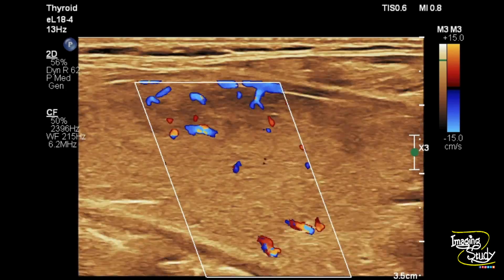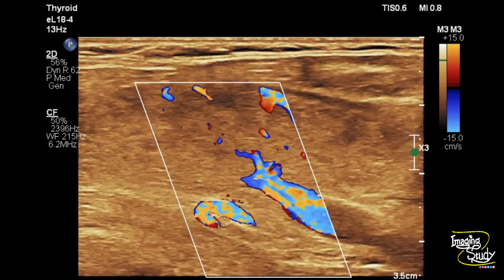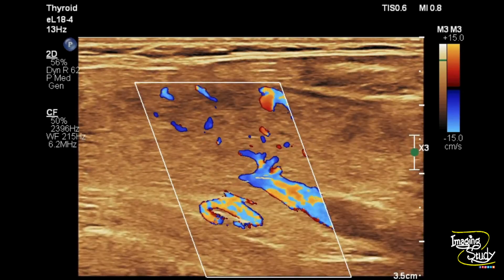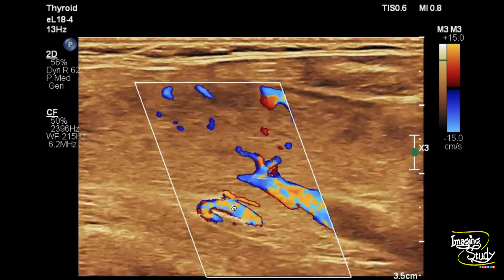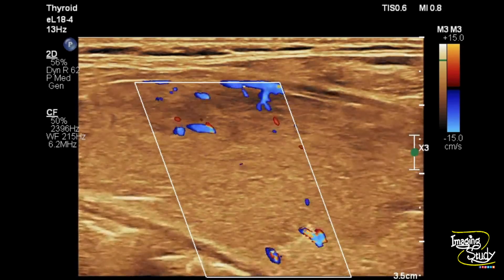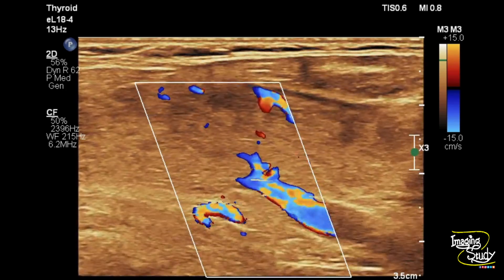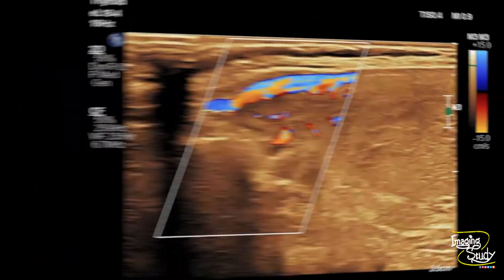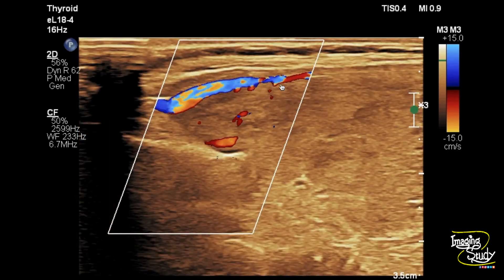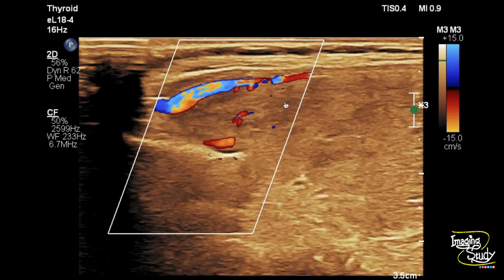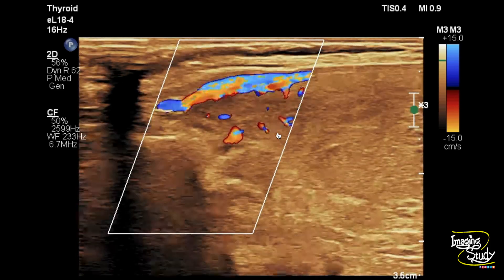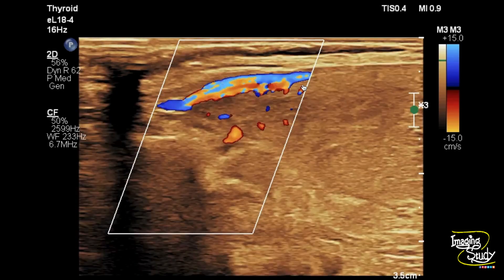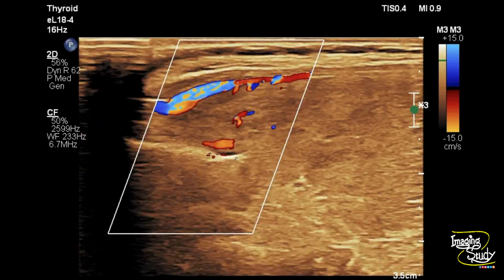Here we have increased the pulse repetition frequency (PRF) so that we can show the main inferior and superior thyroid arteries clearly. You can see this is the inferior thyroid artery entering into the right lobe and giving supply to the parenchyma. This is the right superior thyroid artery, also giving supply to the thyroid gland. With the increased PRF the thyroid inferno is slightly reduced, but you can still see aliasing within the main superior and inferior thyroid arteries.